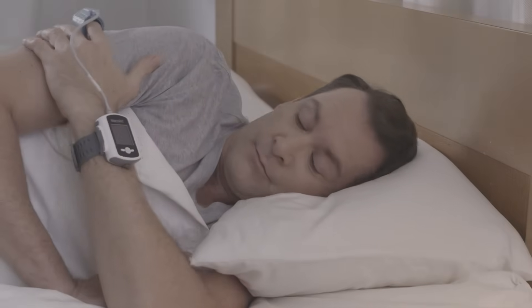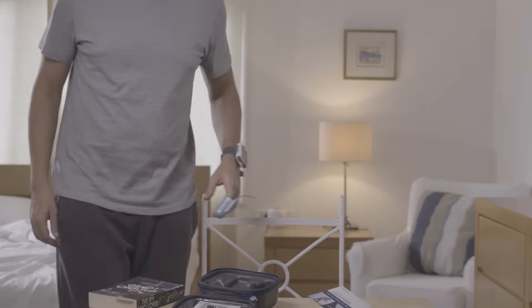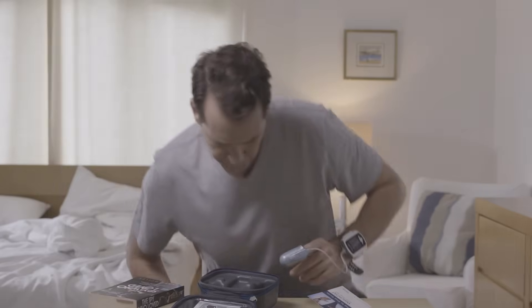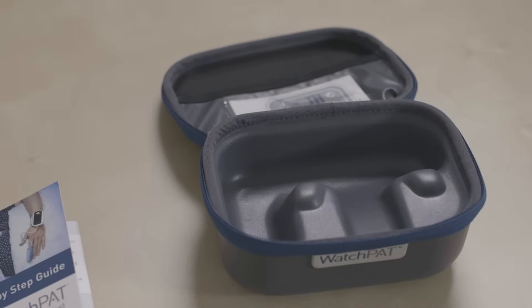And good morning. Remove the probe from your finger and remove the device from your wrist. Please note, WatchPad cannot be turned off. Now, return the device along with the probe to the case.